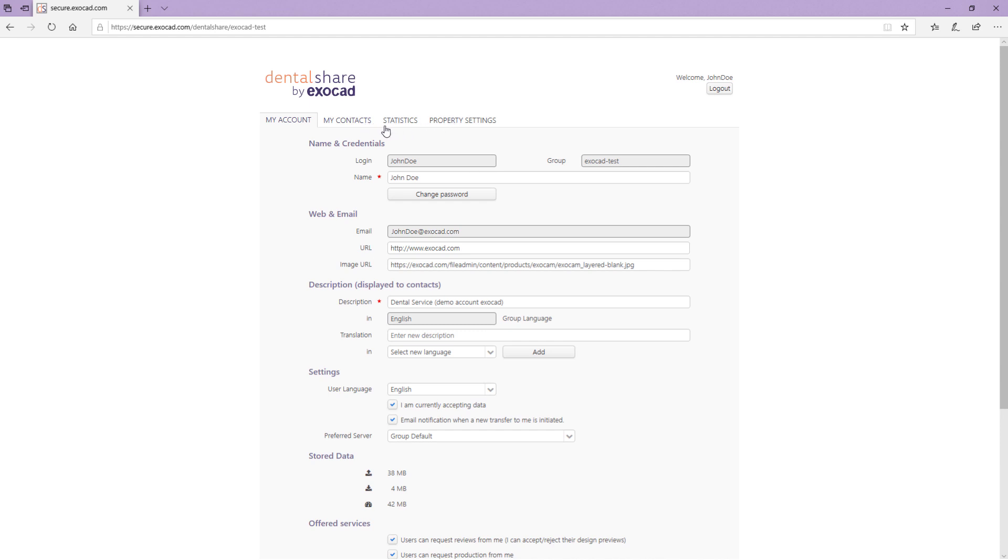Tab My Account displays login name, group and name. You cannot change the login name and group but you can change the name displayed to your contacts. To generate a new password for your account, click Change Password.